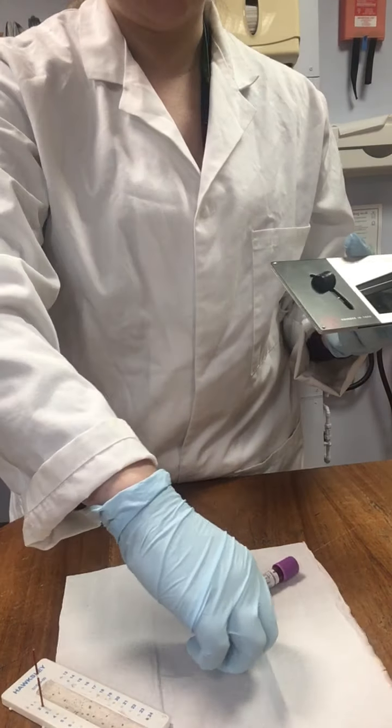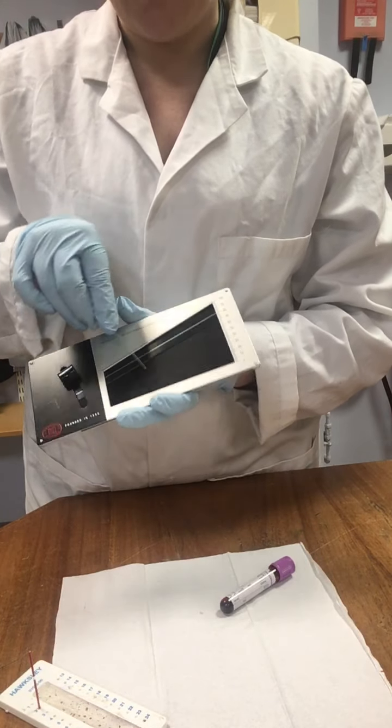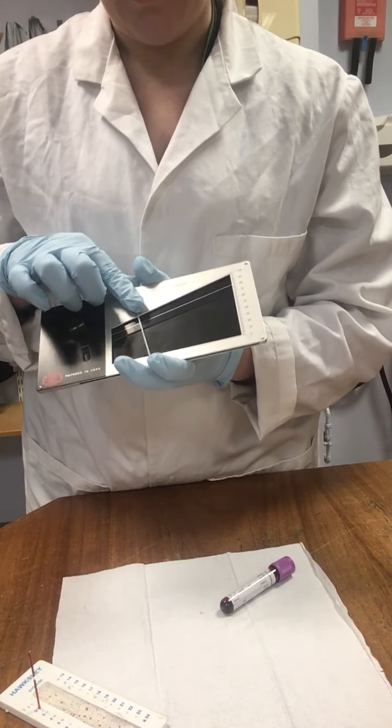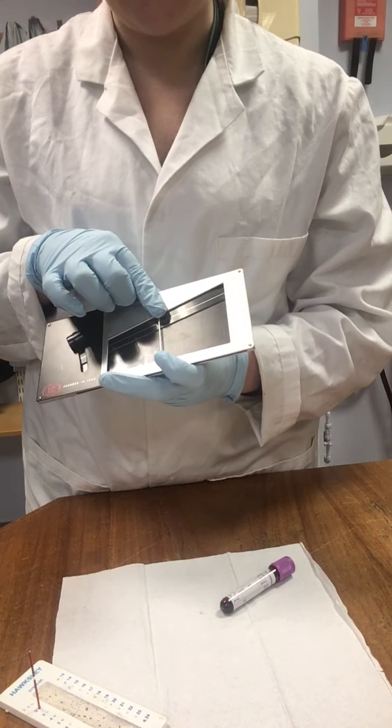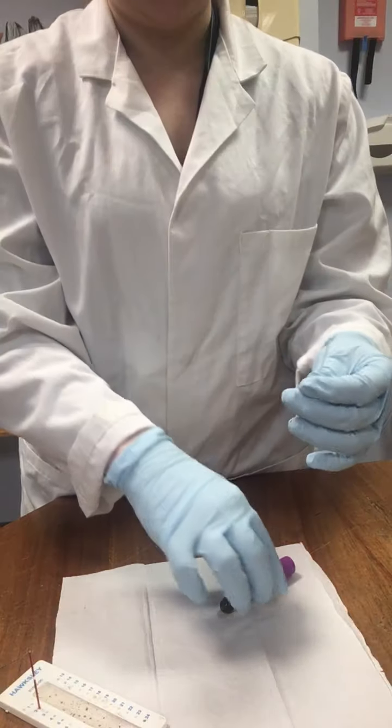And what you can do before, if you are concerned, is you can basically place your hematocrit tube up along the side to be able to see roughly whereabouts two-thirds is going to be. But with this, I know that we can just fill it up to two-thirds.